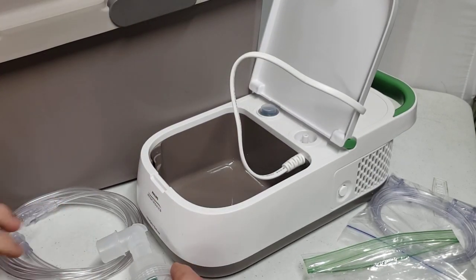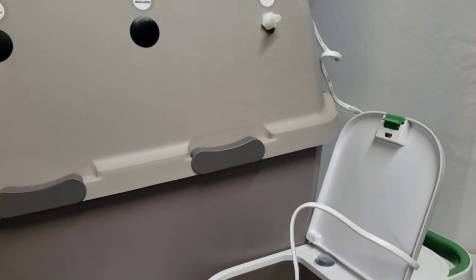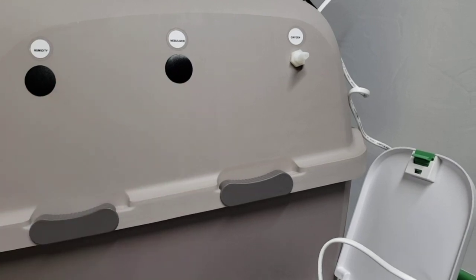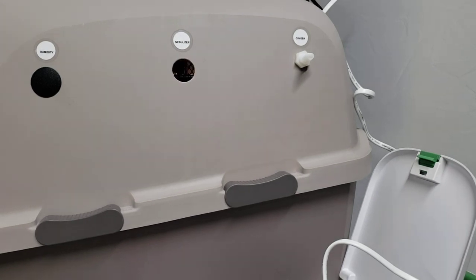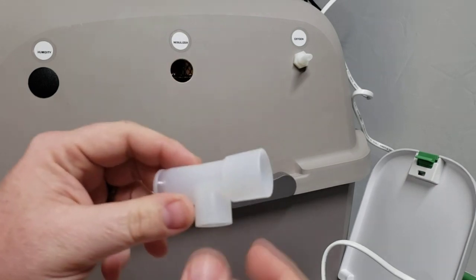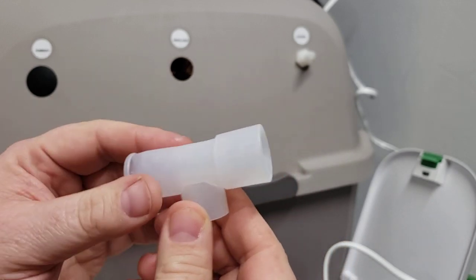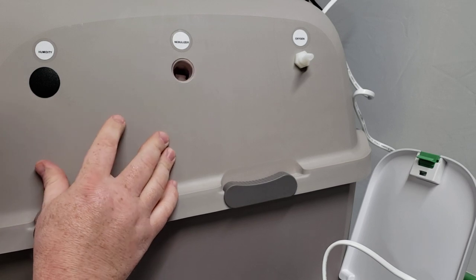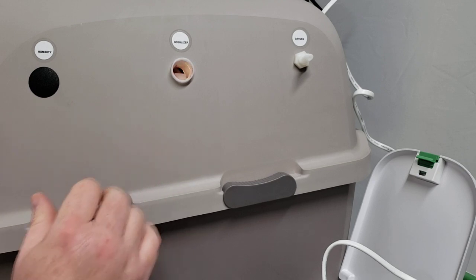The first thing you want to do is reach inside your incubator and pop out that little black tab right here in the center where it says nebulizer. Go ahead and pop that out from the inside — it's easiest just to push it out from the inside. Once you've got that pushed out, you're going to see the opening. Take this large end of the tea adapter and push that through from the inside. Reach around your door from the inside and push that piece through about halfway on that big section of the tea adapter.